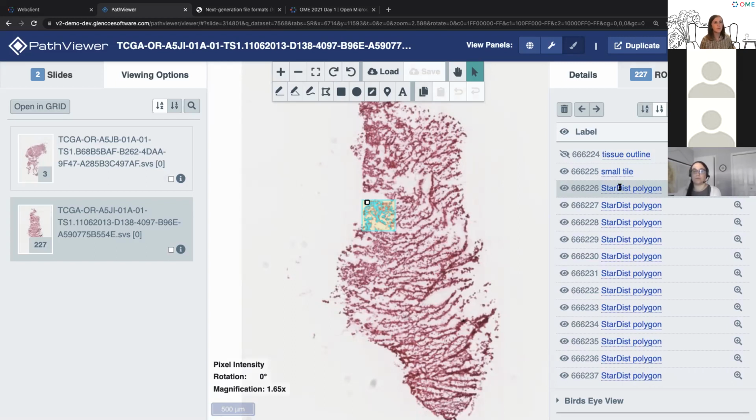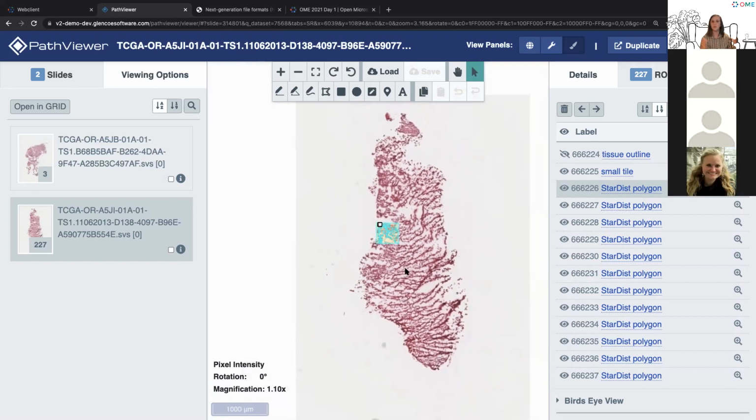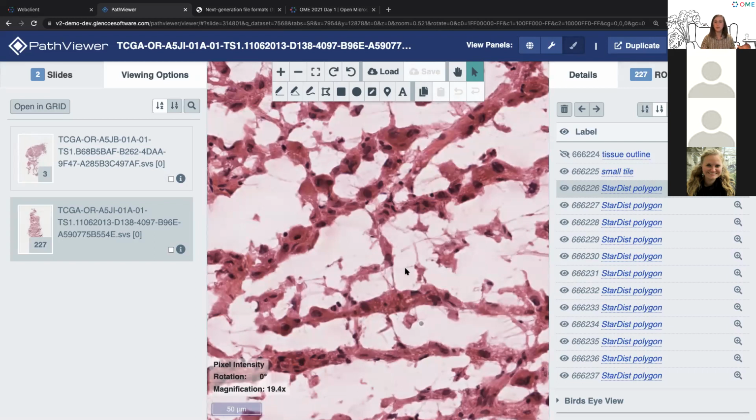Okay. So the way that we've chosen to represent this is actually very similar to the image data itself. The reason for this is when you have so many objects on such a large image, we want to follow some of those same principles that we thought about for the image data itself. I was describing that when I'm all the way zoomed out, I need information across all the tiles, but I don't need really high resolution information. But as I zoom in, I need the highest resolution information, but I need it in a spatially restricted way. And so we want to represent these polygons, these objects, in exactly the same way.